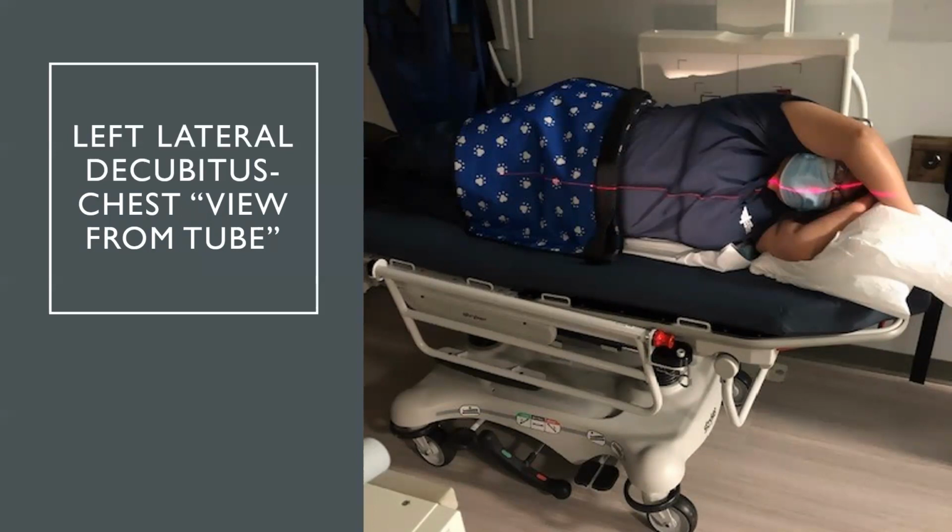Instructions to the patient. For exposure, ask the patient to take a big, deep breath in and blow it all the way out. Take in another breath and hold it. Take the image on the full inspiration.